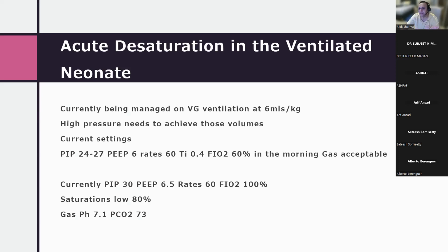So there's no evidence of blood up the ET tube. You have good flow loops on conventional ventilation, indicating that the tube should be in. You've put on end-tidal CO2 and you've got a good trace. There's a slightly prolonged expiratory tail to the end-tidal that you see, but actually there are no concerns with regards to the tube being out. So, from a DOPE mnemonic, the only thing is the right-sided air entry is slightly reduced.